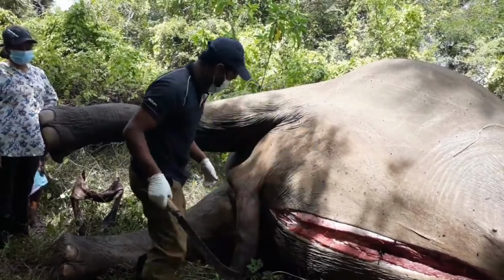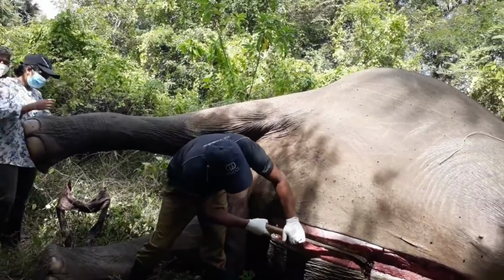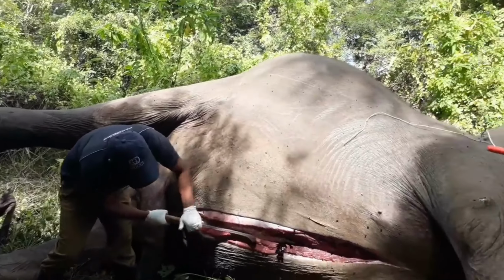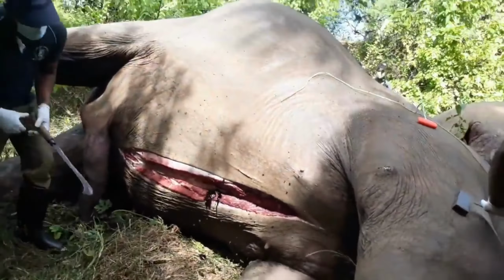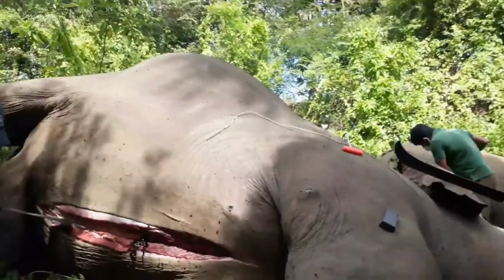One challenge we faced during this postmortem was cutting through the elephant's skin, which had become dry and tough. It took much longer than usual to make the initial cuts due to the thickness and rigidity of the skin. This made the process more difficult, but it's an important part of the examination, and we persisted to gain the insights needed.